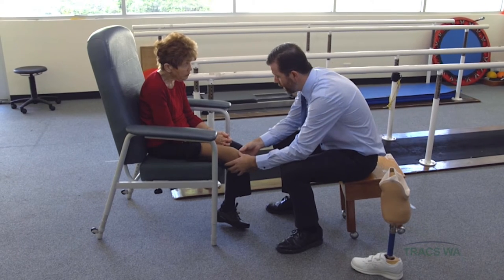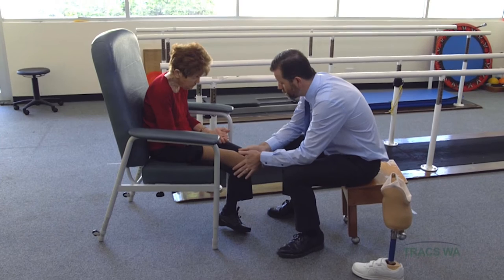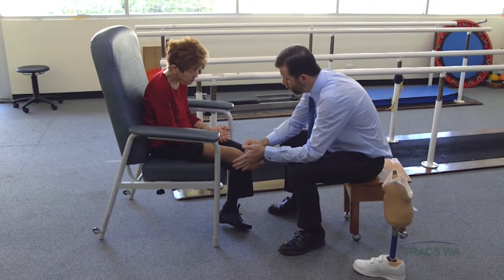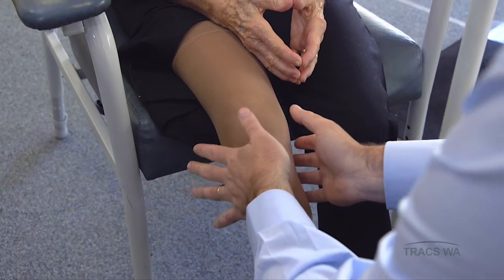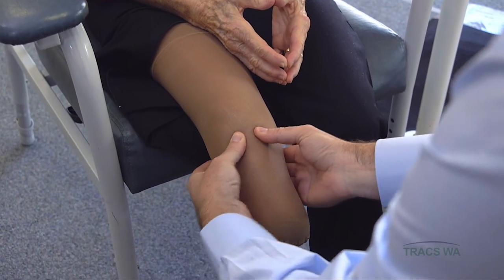The prosthetic socket has to take your weight through the skin of your leg. So we take some weight underneath the knee and at the back of the knee, and on the sides of your leg, but we have to avoid the pressure-sensitive areas — the bony spots that can't take any pressure: your shin bone, the knobbly bits, your kneecap. We take the weight through the sides of your stump, in the spots that can take pressure, avoiding the spots that can't.